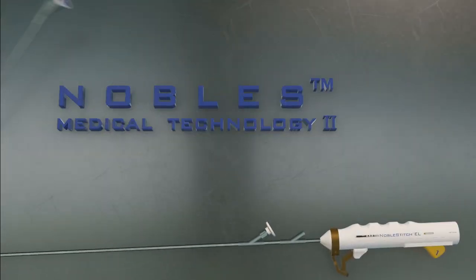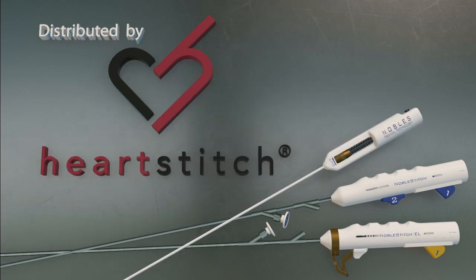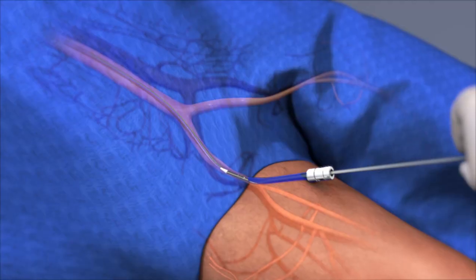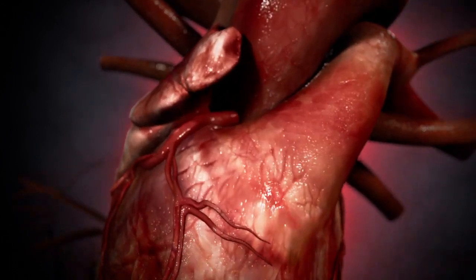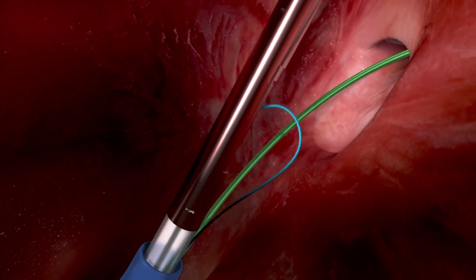Presenting the Nobles Medical Technologies II Nobles Stitch EL PFO Closure Device, distributed by HeartStitch. The Nobles Stitch EL is introduced through a standard 14 French 68 cm introducer sheath and over an 032 wire placed in the superior vena cava, and an 018 wire placed through the PFO into the upper pulmonary vein.